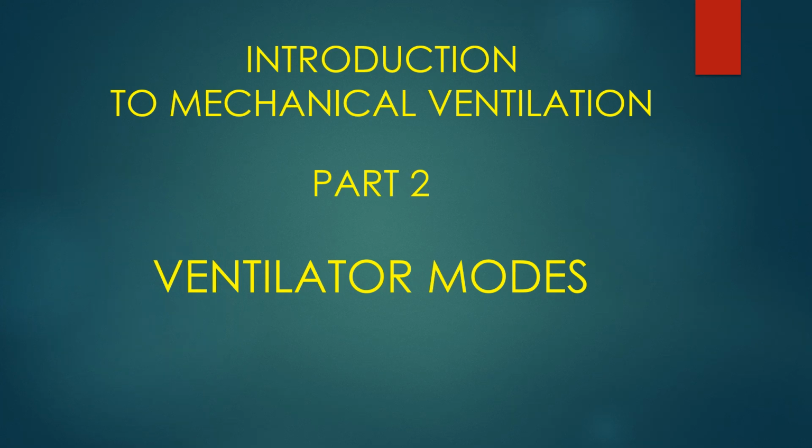Ventilator modes. Ventilator modes are one of the most confusing parts of trying to learn about mechanical ventilation. It shouldn't be that difficult. We're simply talking about the type of breath being delivered from the ventilator, whether the ventilator is targeting pressure or targeting volume, and whether it's spontaneous breathing, the patient breathing, versus the machine breathing, which we call mandatory breathing. So there's spontaneous breathing, mandatory breathing, and we're targeting pressure or we're targeting volume. So it shouldn't be all that difficult.